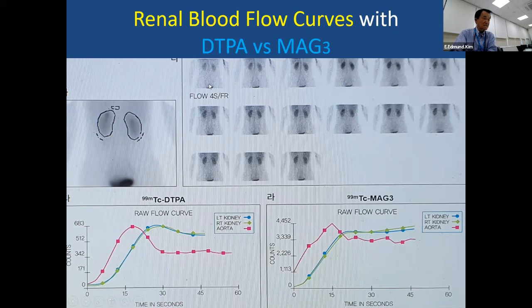Soon after you inject, you run the renal study. Ideally, we use the camera positioned at the back of the patient in an upright sitting position. That's a physiological position, so it drains by gravity. If we put the patient supine, the UV junction is like a hump, so some may not drain well.